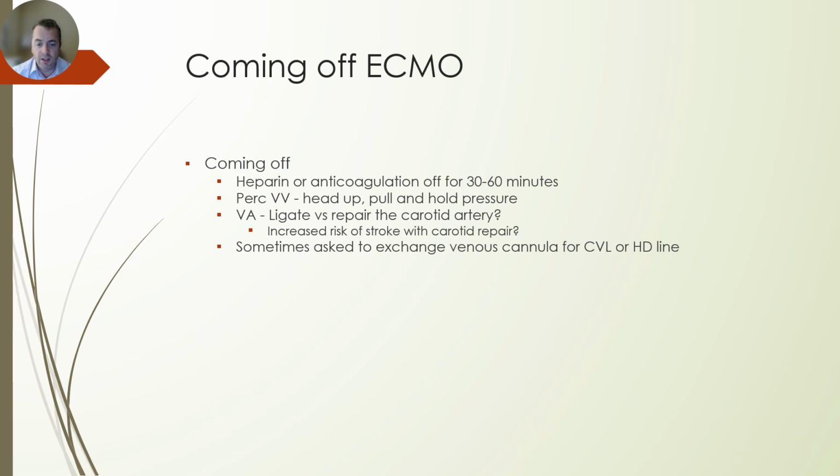the vessels. Some folks do repair the carotid artery, especially if it's been a short duration and the vessel integrity has not been compromised by a long duration of ECMO, and the size of the patient lends itself more towards a repair as well. This remains controversial, and some folks feel that there's an increased risk of stroke with carotid repair due to either stenosis or intimal injury, whereas if the vessel was ligated, that would not be a risk.